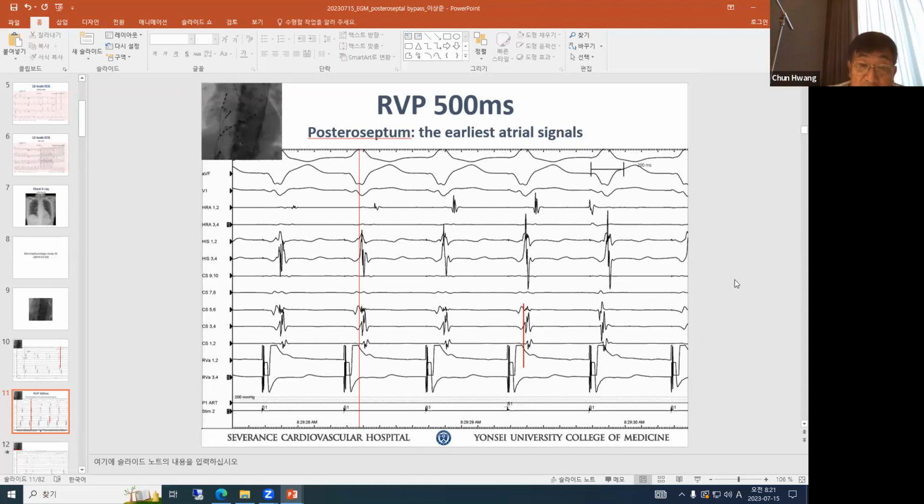Because especially the CS activation is very parallel, almost inseparable between B3, B4, and proximal CS. Because your wavefront travels along the pathway, it looks almost like a merging thing. So for us to appreciate that, if you change the directionality of the wavefront from the ventricle, you will separate it out better. Then you will be able to see more pathway potential that way. Okay?